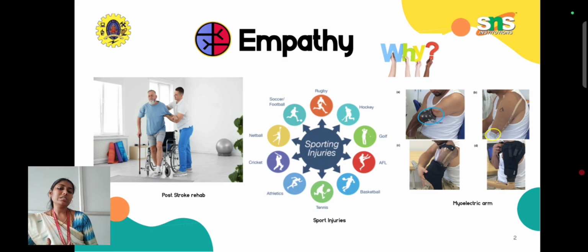Since the EMG device will give you the detailed muscle activity or the functionality of a particular muscle, it helps the physiotherapist to further follow up their treatment or to see the recovery stages of people. That is one kind of problem which is addressed by the EMG device.